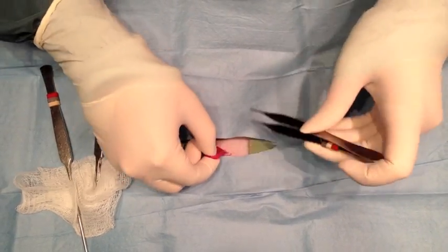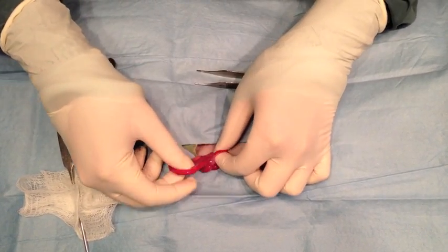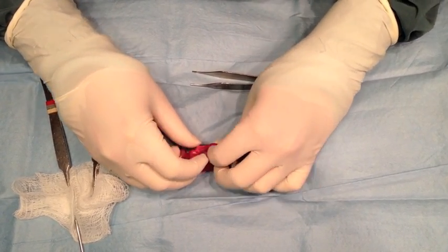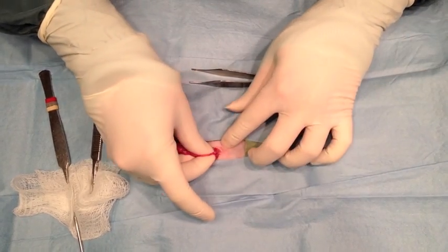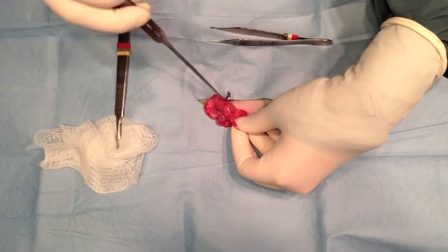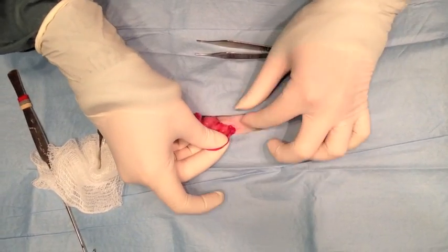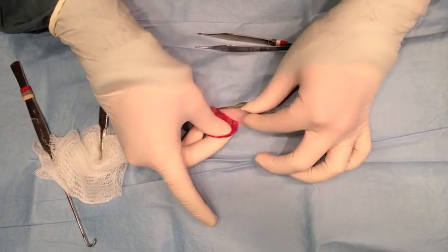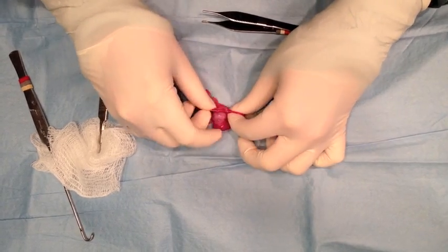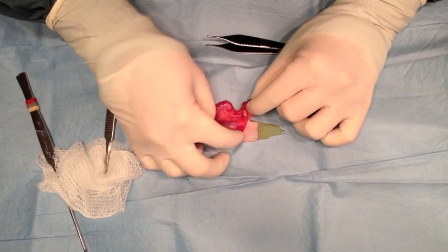As opposed to a dog or cat, there it is — it's very pink compared to the rest of the intestines in a rabbit, very very pink. Here I am gently trying to bring the ovary up to my incision. There's a lot of oviduct in a rabbit and the ovary kind of sits pretty low in there. If you pull too hard, everything rips, which is one of the many things that makes doing a rabbit spay really pretty sucky. I'm just gently pulling out — with my left hand I'm just hanging on to the oviduct.